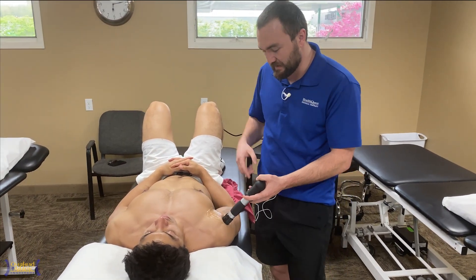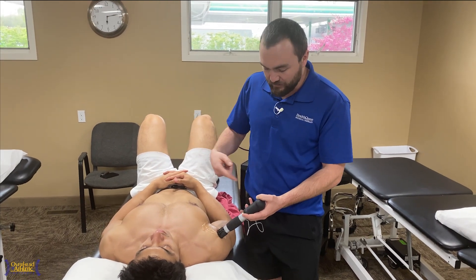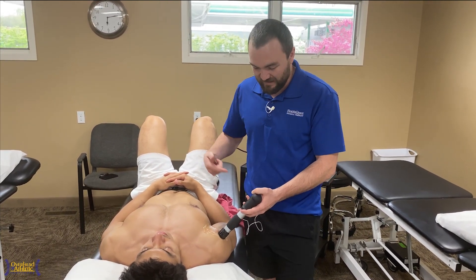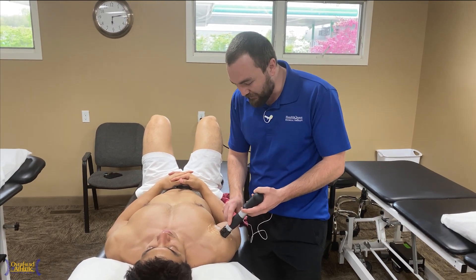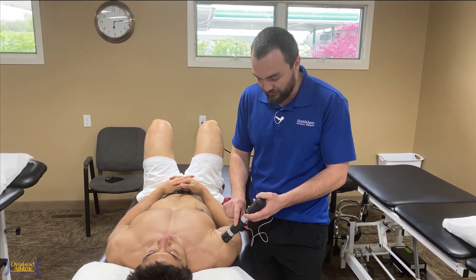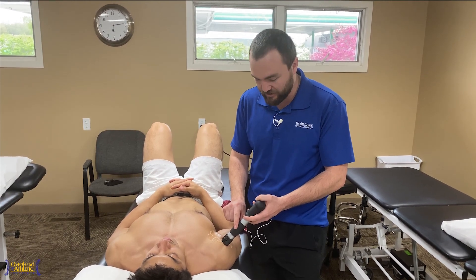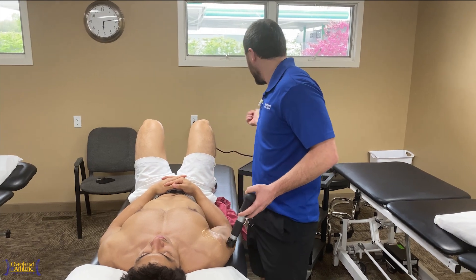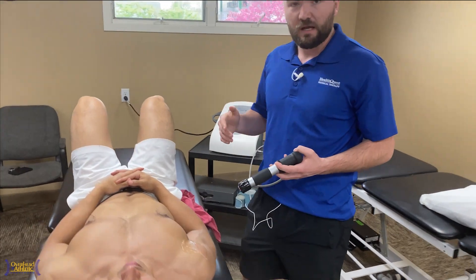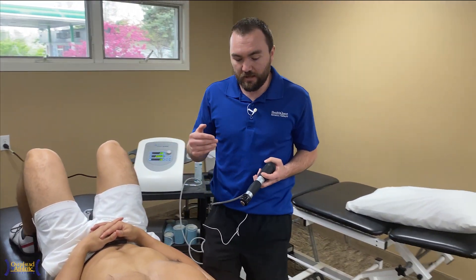After we get done with this, that's when we get out into the gym and start beginning with some exercise-based therapy. We move it around. Now, if we had calcific tendinosis or something, we could hold over one specific location. In this case, we just want to hit the entire anterior capsule. We've capped out at 2000 beats, which is exactly what we want to hit there.